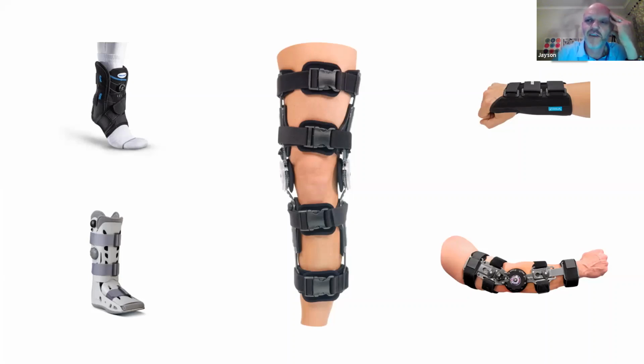You get highly effective knee braces, like an osteoarthritis knee brace, where you can unload a medial compartment of an osteoarthritic knee for years and years in a patient if they're too young, until they've really worn that knee down, and then perform a knee replacement. We've got examples of simple ankle braces, moon boots, elbow ROM braces. These are some of the very commonly used braces, and we use them both post-operatively and then return to activity.